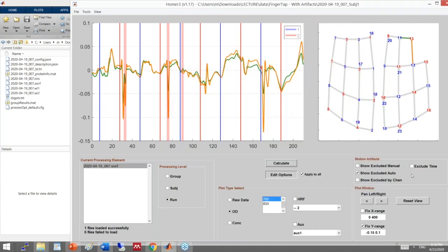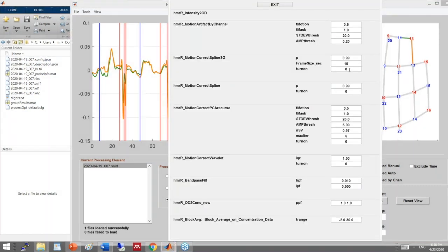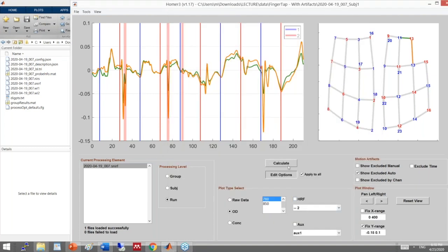Now I turn on the spline-SG hybrid method. This method identifies different types of motion artifacts — baseline shift type and spike type — rather than treating every signal change as a motion artifact. It corrects spikes using a method similar to the outlier approach, and corrects baseline shifts using spline interpolation, which is well suited for that. Let's see what it does.